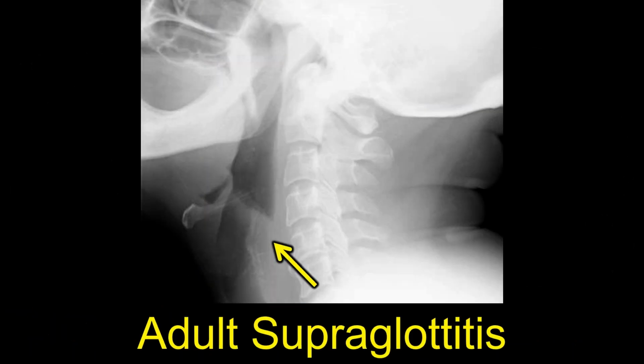Now, this is one of the few areas where plain film is actually used in the head and neck work. Plain film is amazingly bad for trauma if you're trying to see fractures or to evaluate sinus disease, but in children especially, as well as adults, when we're sometimes evaluating the upper digestive tract, this is one of the few areas where plain film is still used and thought of as effective in the head and neck world.